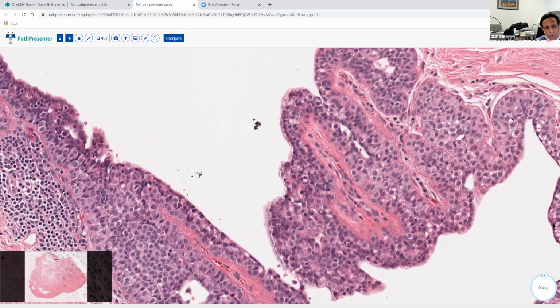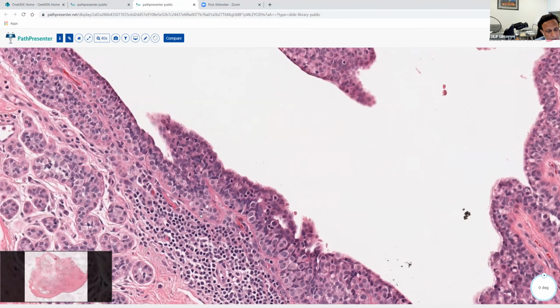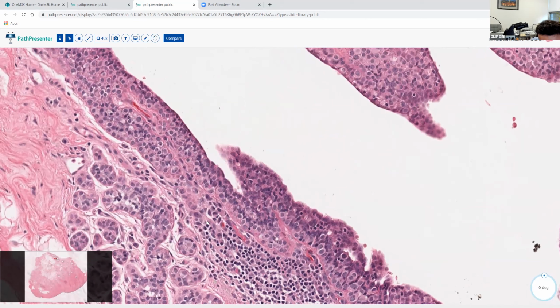Now, occasionally, very minimal in situ carcinoma, DCIS, low grade, may involve a few small ducts in a biopsy. And then the question will be, I mean, you will probably do E-cadherin. I mean, you should do E-cadherin anyway, if in a biopsy all that you see is just Pagetoid spread along the duct wall, because in LCIS you want to see acini, right? Those telltale small acini that group together. This is the picture that we have right from our medical school days of what LCIS is like.